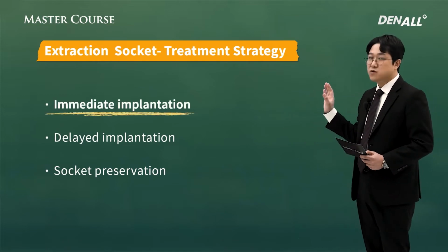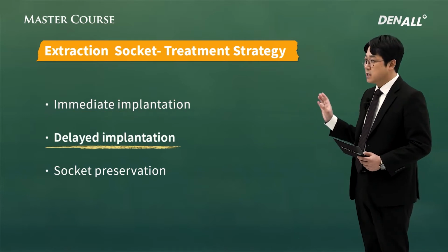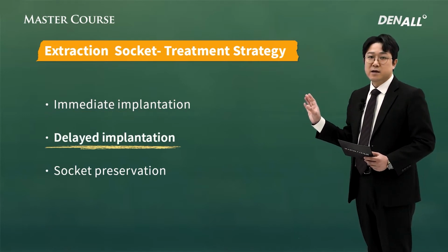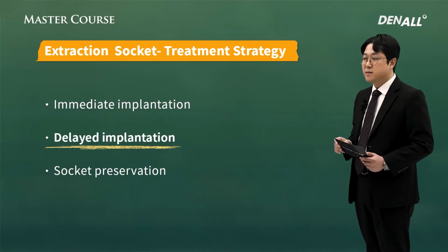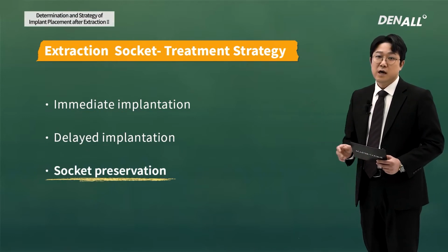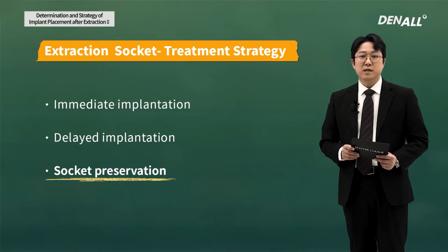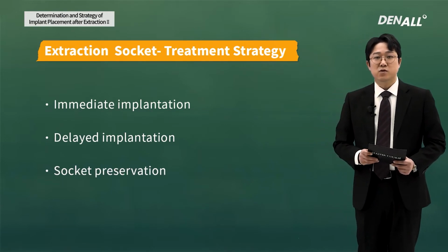First is immediate implantation. Second, the period may vary, but it is delayed placement. And third, there's socket preservation, where you prep the surgical site and wait. These are the three ways.